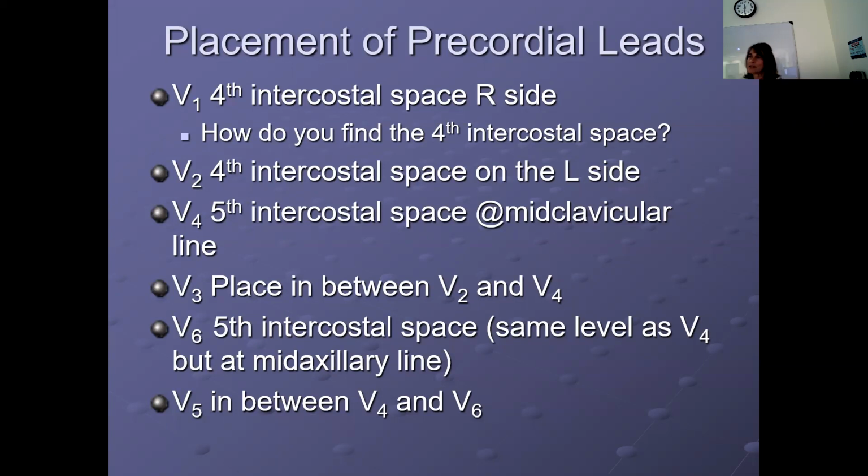Then you're going to put a lead directly across from that on the left side. So that's going to be V2. That's where V2 goes. Chris?